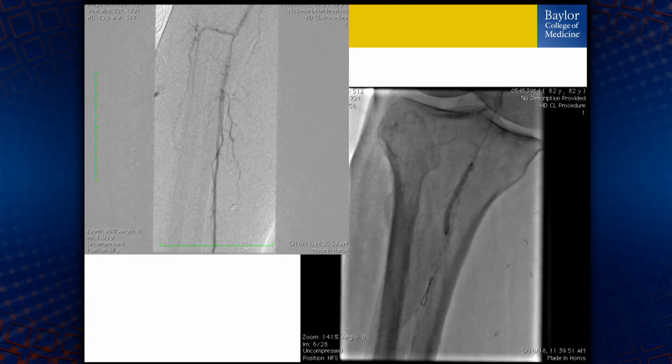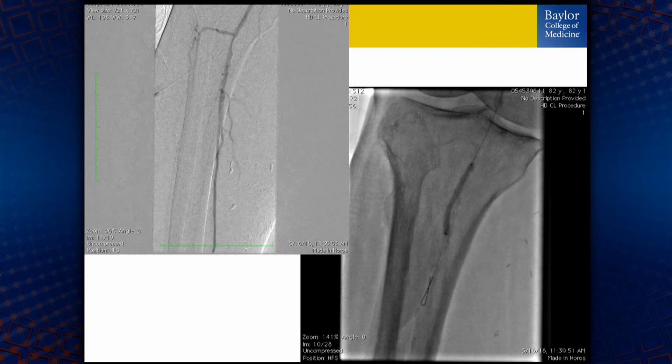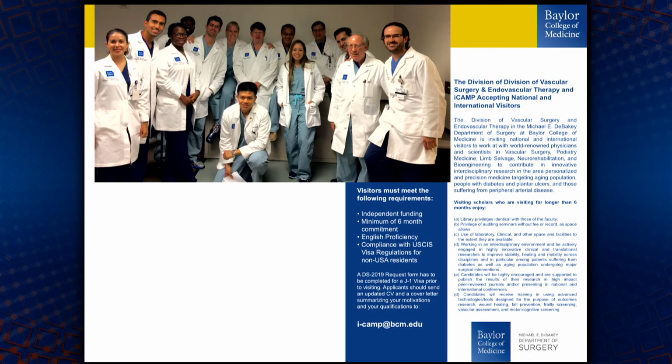And this is a very crucial part of it: you wire distal to your access site and then pop up a balloon, especially when your access site is in a very diseased segment of the artery, because you can very easily create a small dissection by just your access wire. So as the balloon goes up, the micro-access catheter is pulled up, and then hemostasis is accomplished.